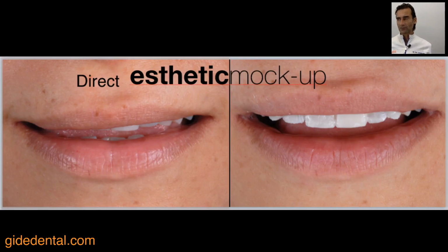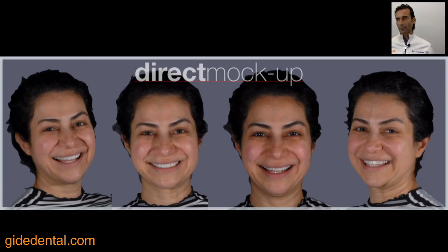So here you can see the direct aesthetic mock-up, and again, you notice here that in the rest position of the patient, on the left side, no lengthening of the incisal edges. On the right side, you can see just in rest that she's showing already a nice amount of positioning. Also here with the direct mock-up, you can almost see how the patient is already happier and smilier and shows much more beautifully her anterior teeth.